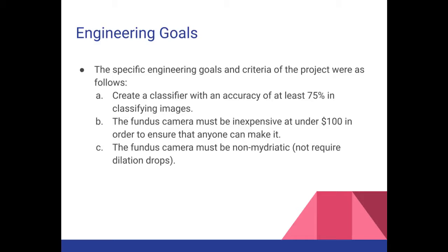So some engineering goals for this project. The first one was to create a classifier with an accuracy of at least 75% in classifying images. The second was that the fundus camera should be under $100, and it should be non-mydriatic, and that means not requiring eye drops.